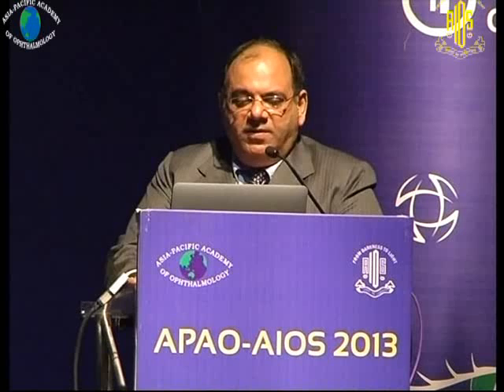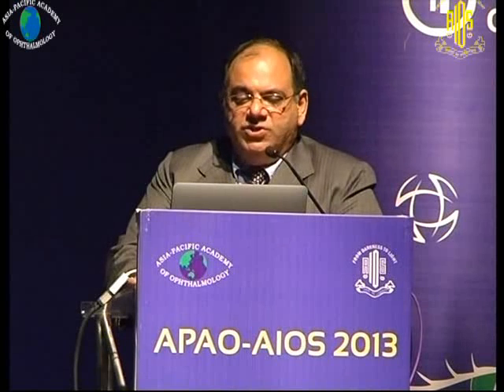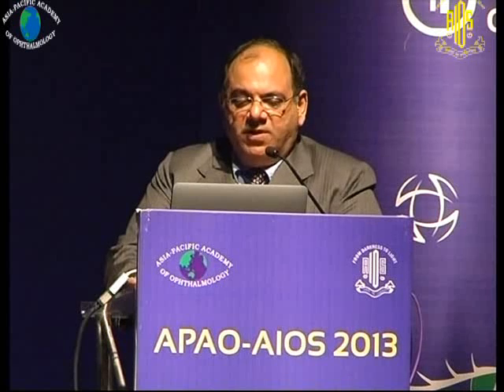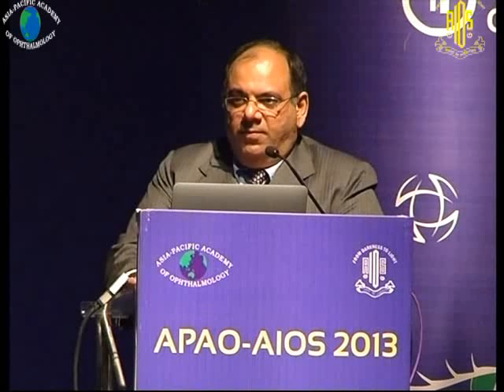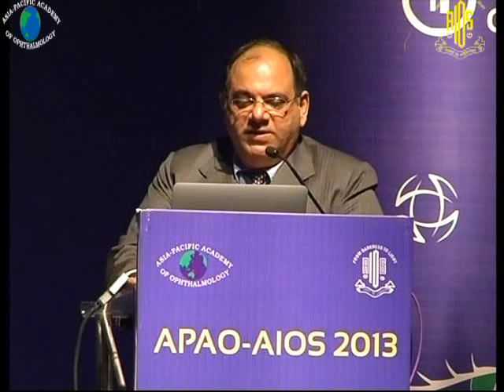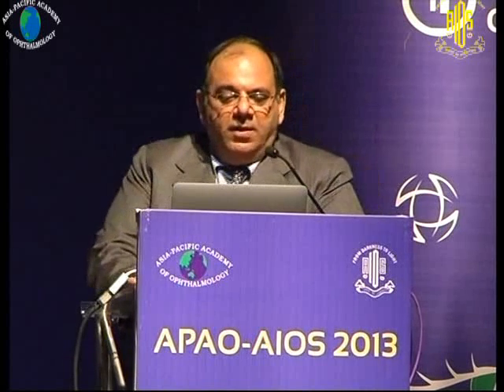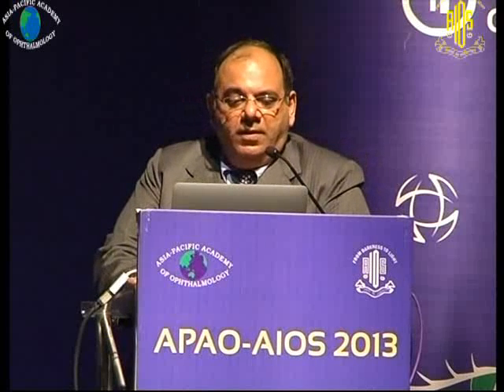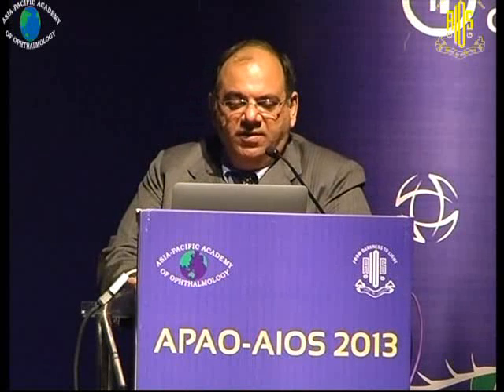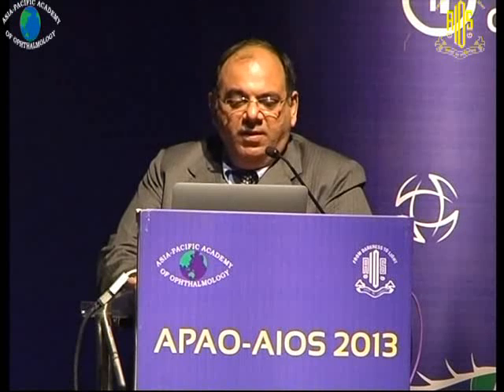Another case of epiretinal membrane was just 2 days post-operative with a combined procedure, in an insulin-dependent diabetic with posterior subcapsular cataract with advanced PDR and macular hole. It's always a good idea to combine. You have a good post-operative picture, and you can even do your OCT on the 4th or 5th post-operative day and see your result. There might be an increase in macular edema, as in any cataract surgery and also in combined procedures.